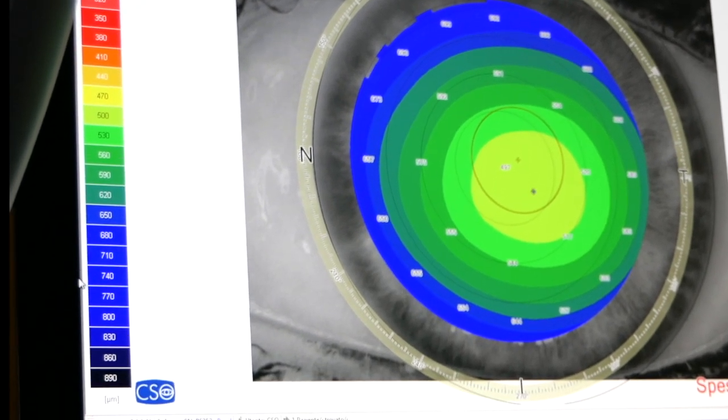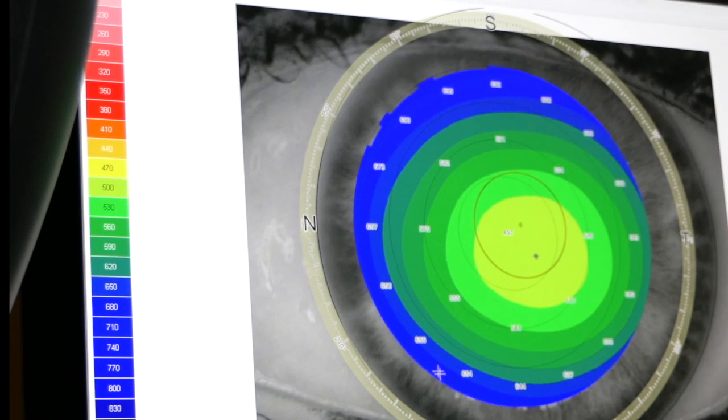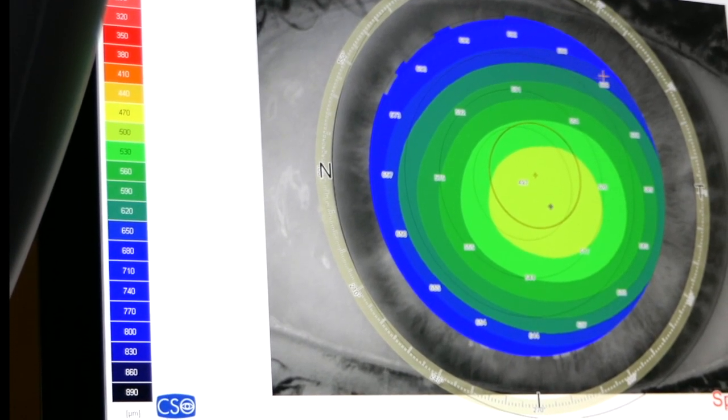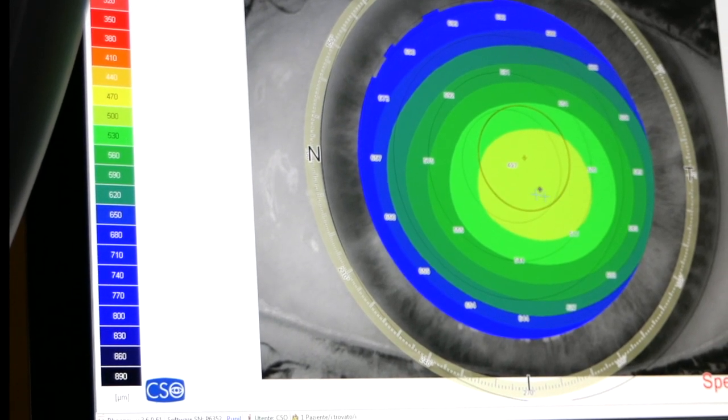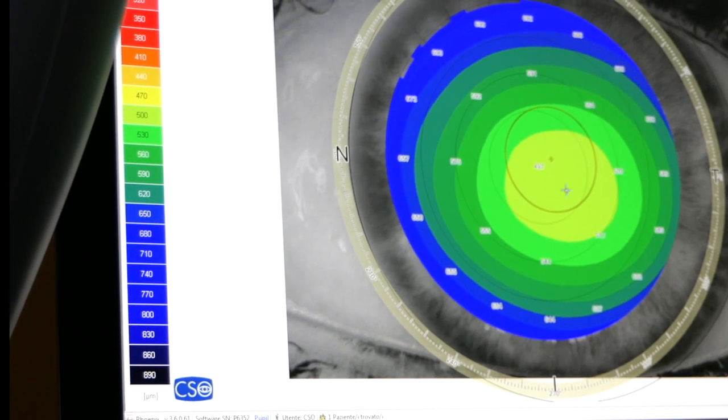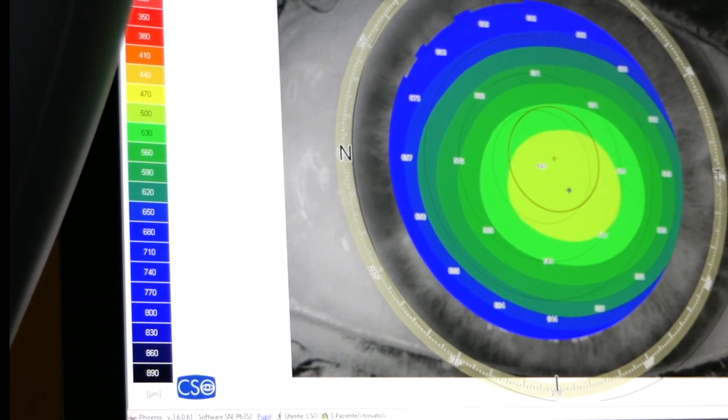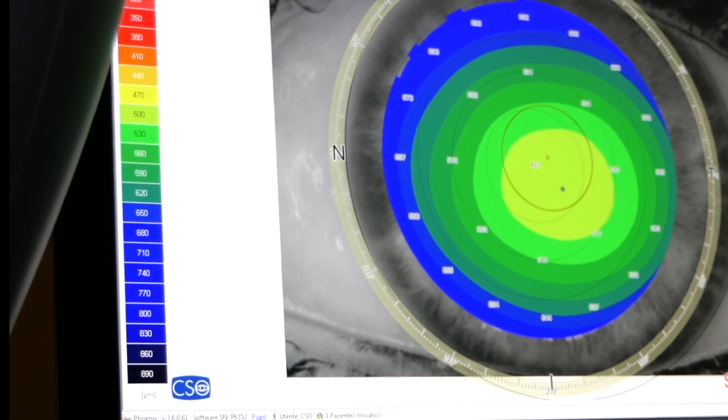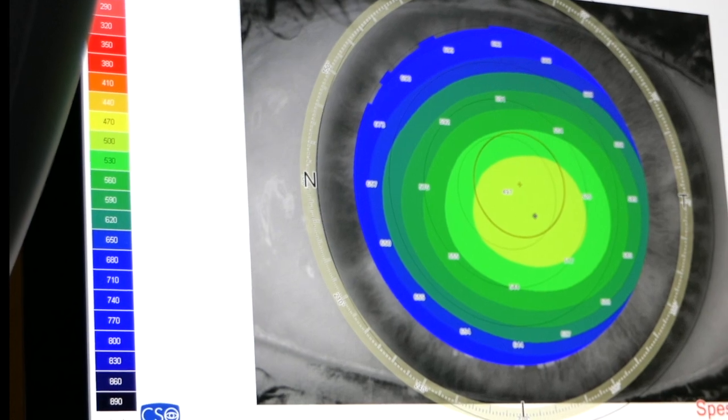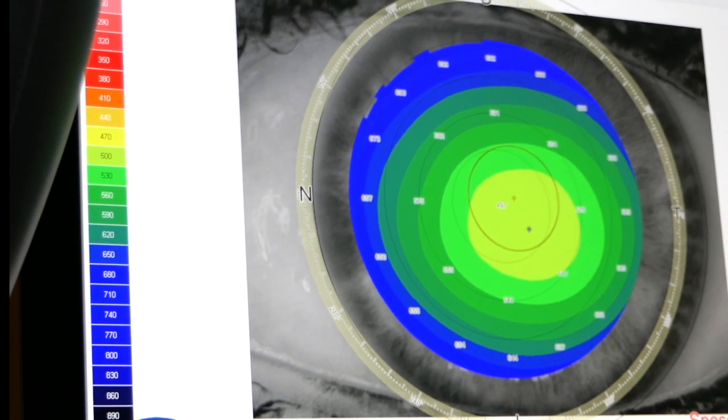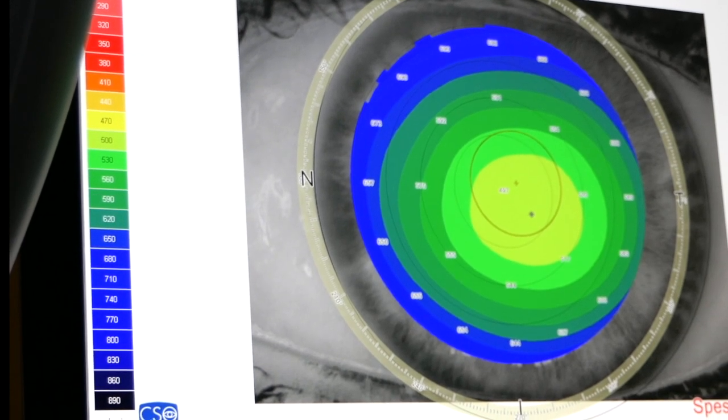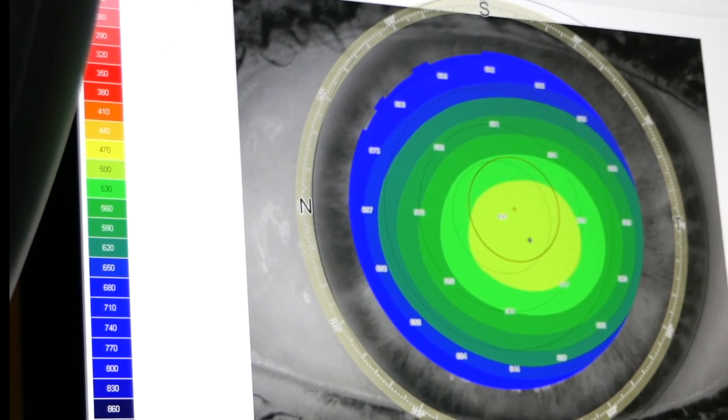As can be seen from this representation, this corneal thickness, also called pachymetry, the thicker the cornea is, the more one goes to the periphery. The blue colors are represented in the most peripheral part of the cornea, and the thinner it is, the more it goes towards the center, and the thinnest point is represented here.